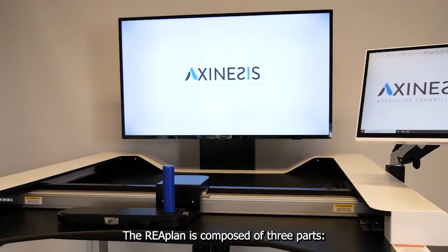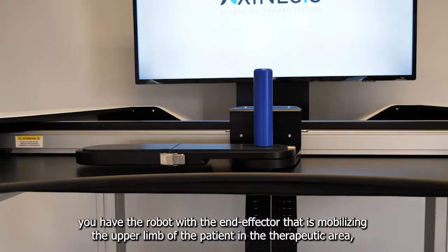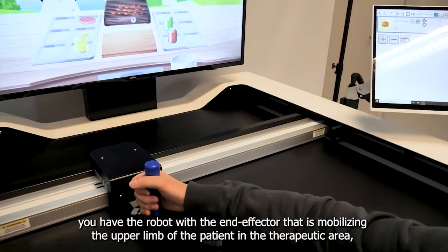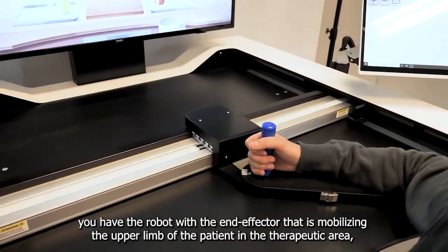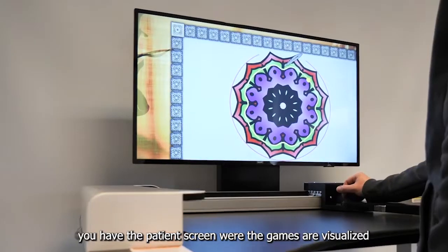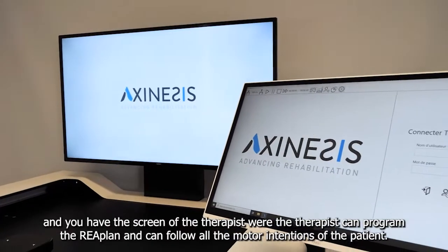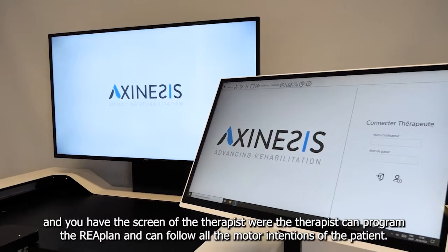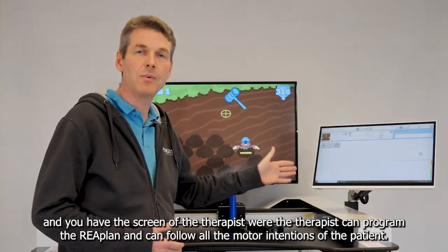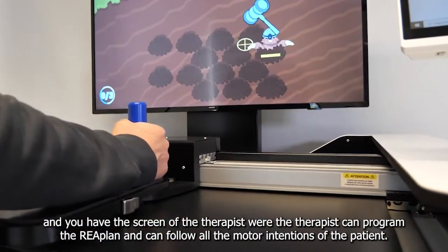The Reaplan is composed of three parts. You have the robot with the end-effector that is mobilizing the upper limb of the patient in the therapeutic area. You have the patient screen where the games are visualized, and you have the screen of the therapist where the therapist can program the Reaplan and follow all the motor intentions of the patient.